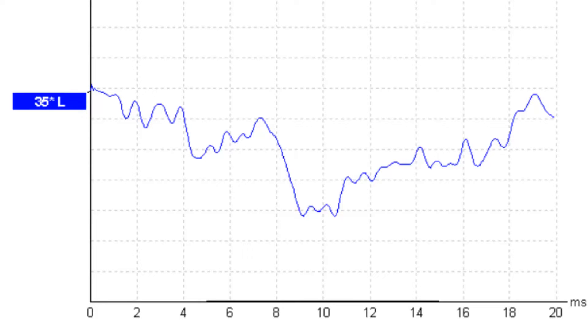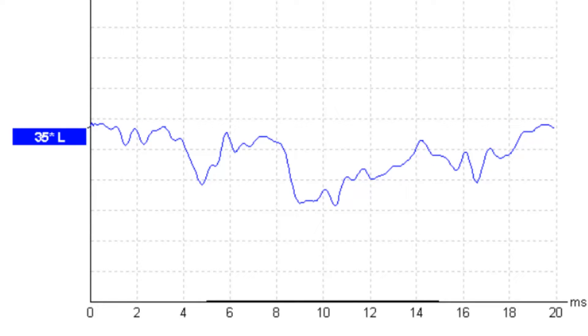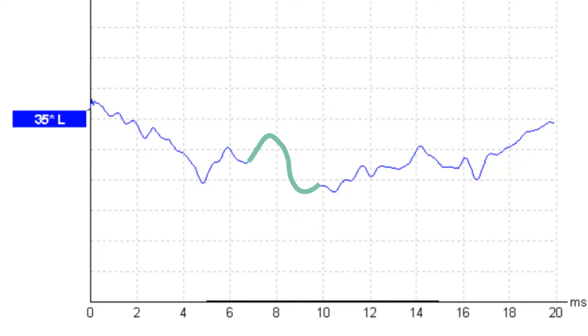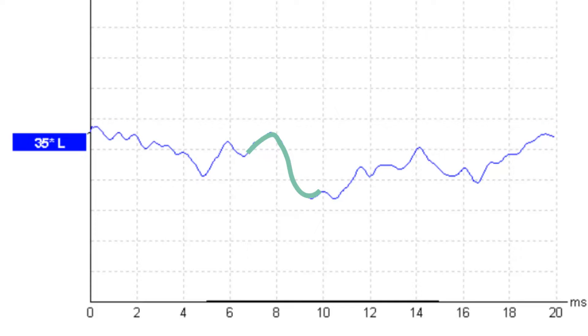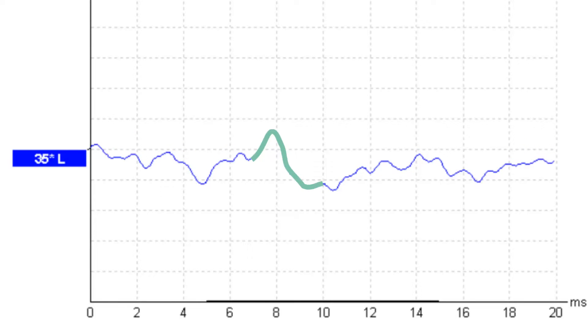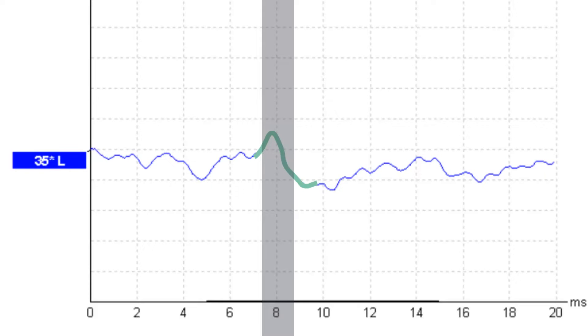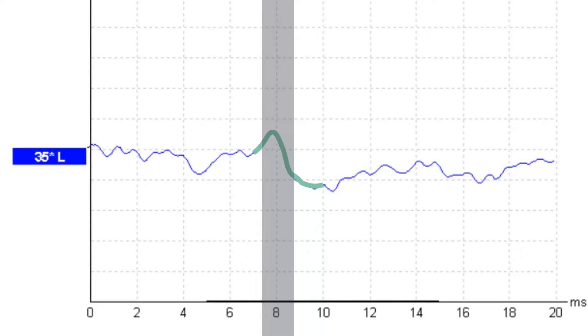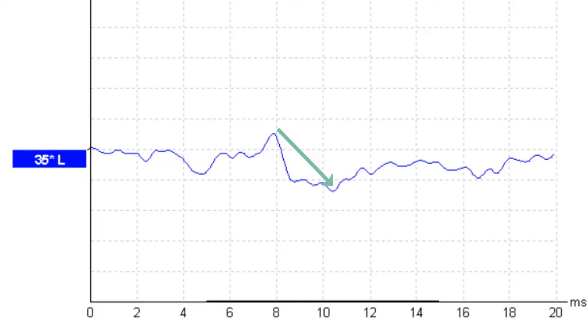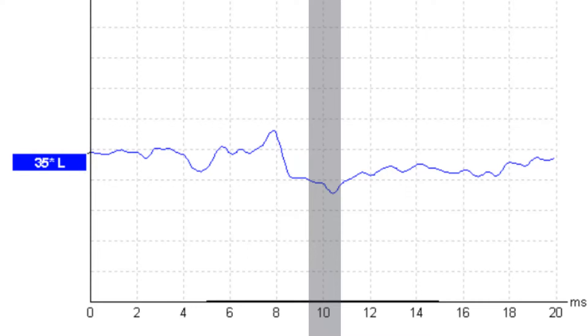As the test continues to run, more sweeps are recorded which contribute to this overall averaged waveform. We can already see what looks like a typical ABR waveform appearing. We have the characteristic wave 5 morphology. Wave 5 generally appears at around 7 to 9 ms at this intensity level, but latencies will vary depending on age, stimulus type, and intensity level. In this case, wave 5 looks like it is emerging at around 8 ms. We can see the characteristic upward deflection of wave 5, followed by the trough, or the SN10 as some people call it, which typically descends to a point at around 10 ms.